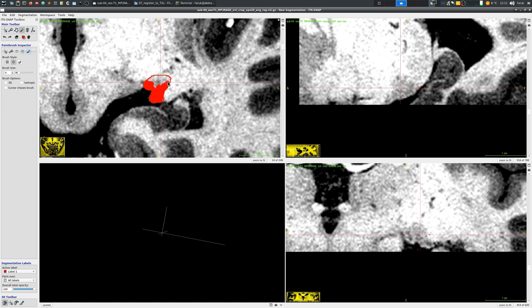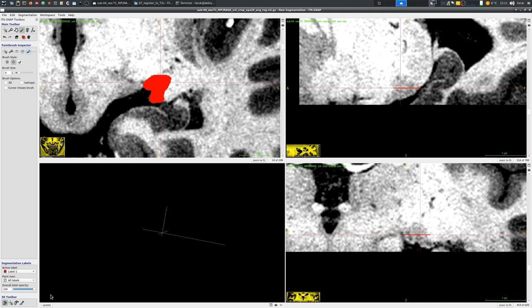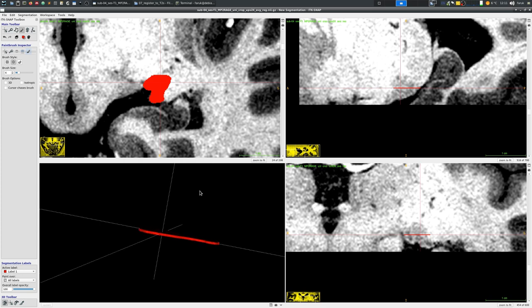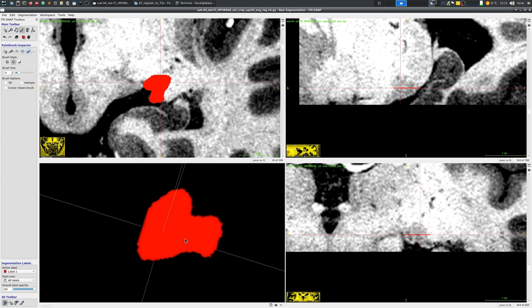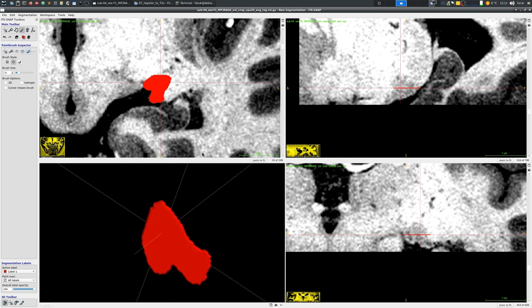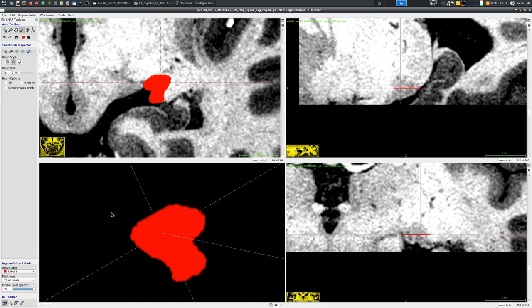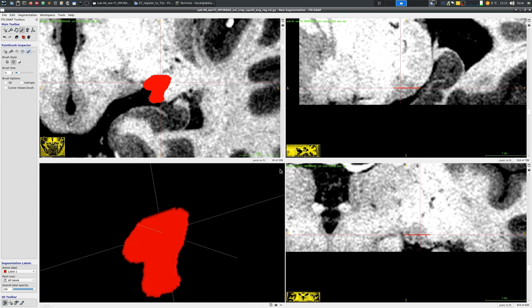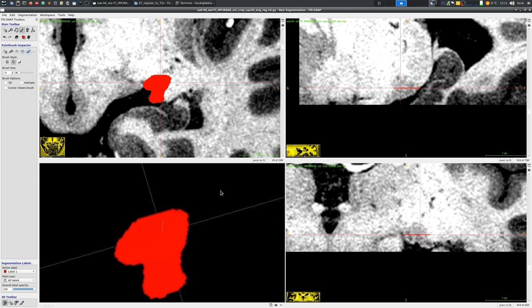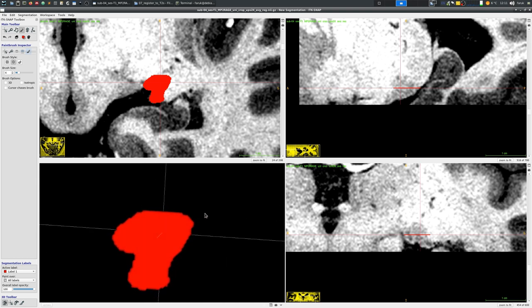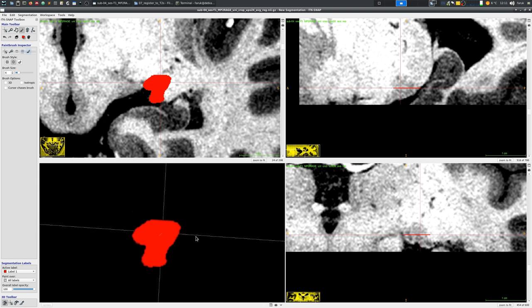Now I selected a circular brush with a decent size, six voxels in diameter I believe, and now I'm going to basically go through slices and then start labeling my subcortical structure. One important and useful panel is the fourth panel that you see on the lower left part of the screen where you can basically immediately 3D render your segmentation.